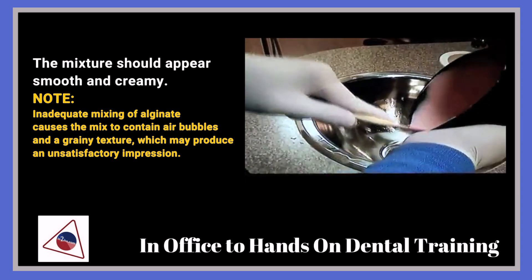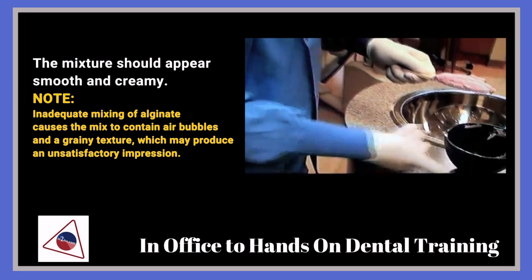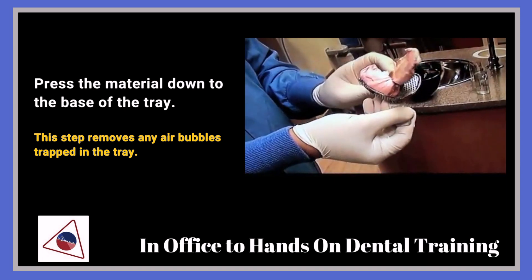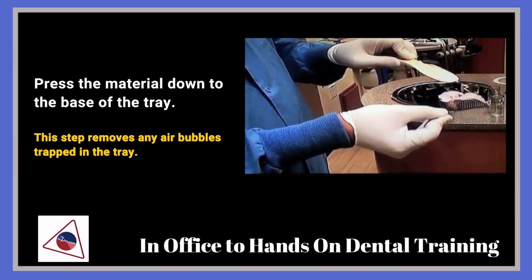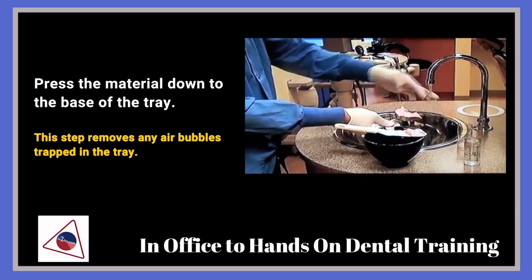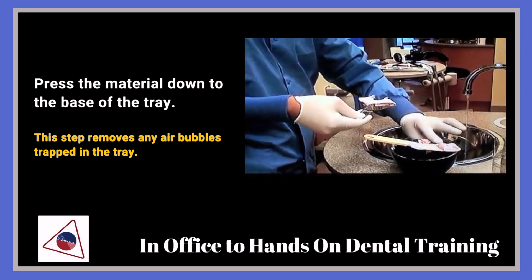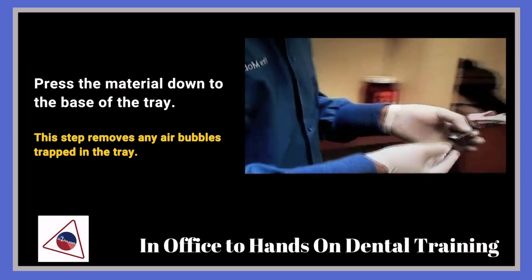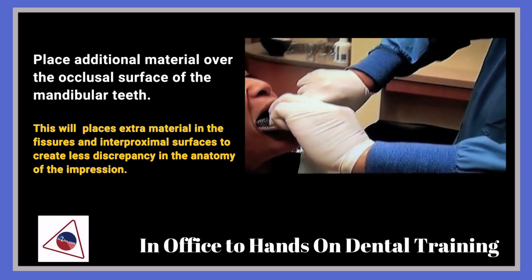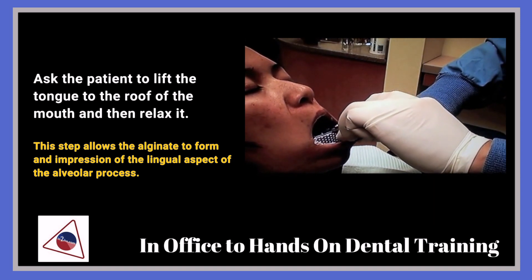The way you put this in is you put one end of the tray and then the other. Place the tray in on one side — relax your lip. Tell the patient to relax their lip, starting from the back end, moving towards the front.